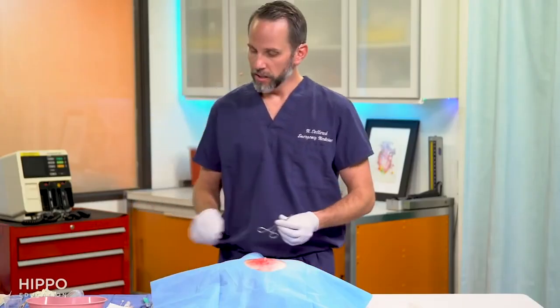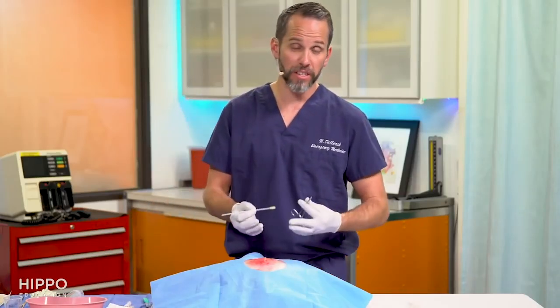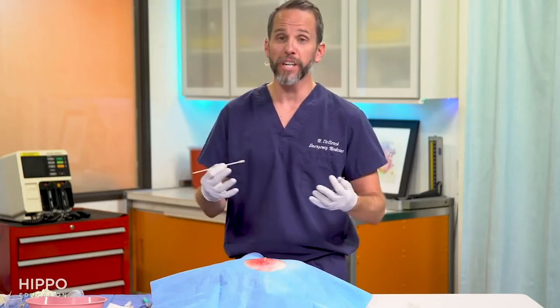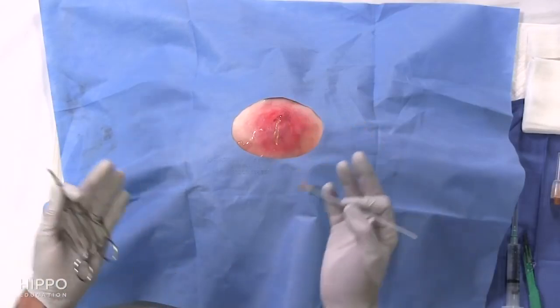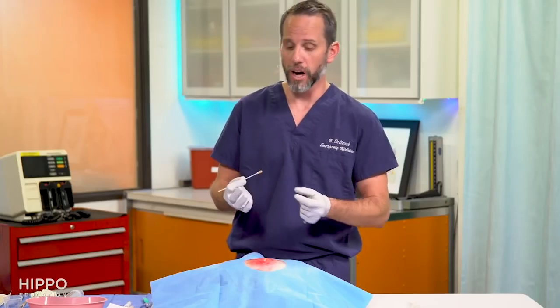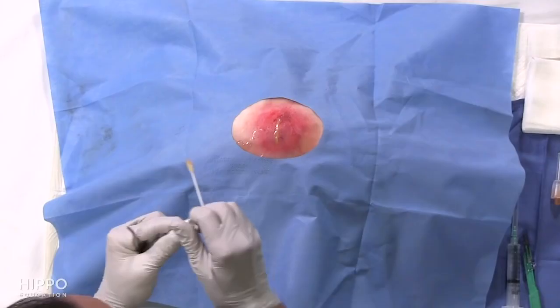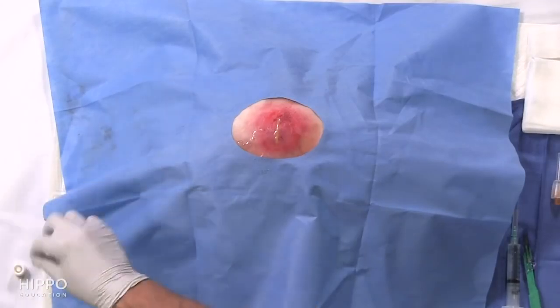Put your blade away. The next step is culturing. You don't always have to culture abscesses, but if this is a complex infection, an immunocompromised patient, or a recurrent abscess, culturing the purulent material helps narrow down antibiotic choices. If the infection isn't responding to the I&D or gets worse, you'll already know what organism was causing it and can be more specific with antibiotics. Not always standard, but in complex cases, always a good idea.